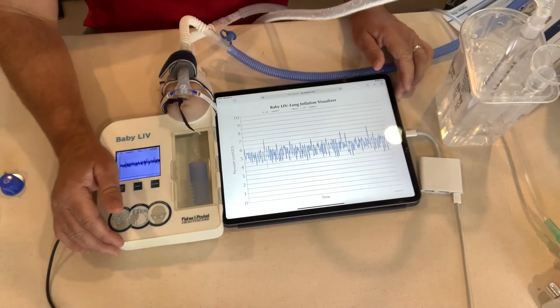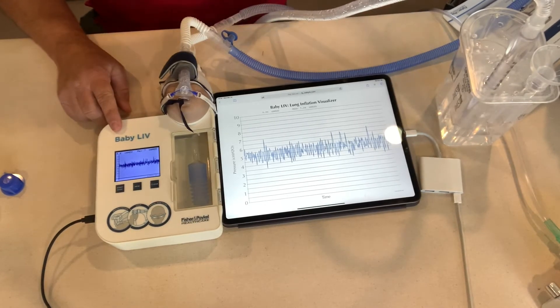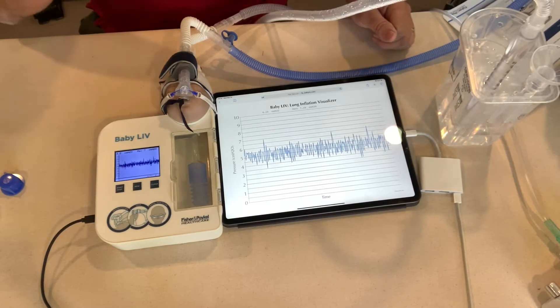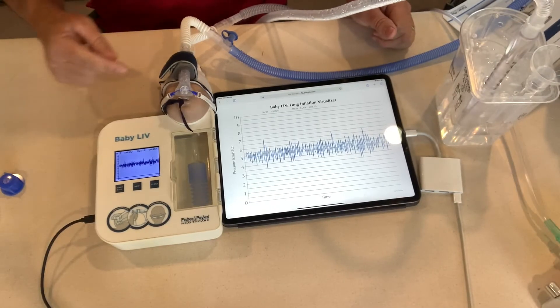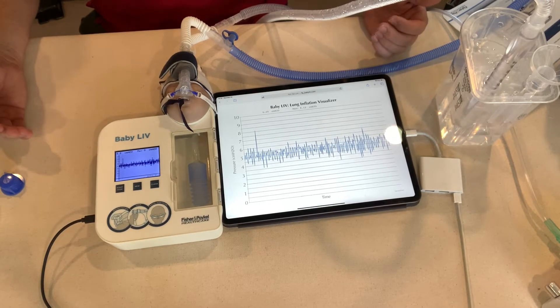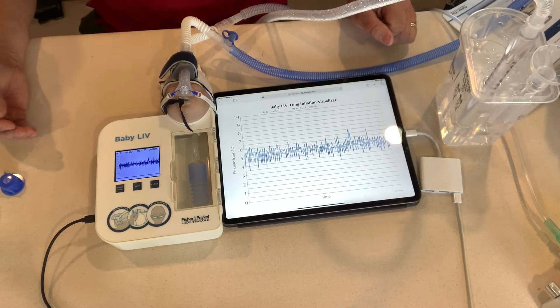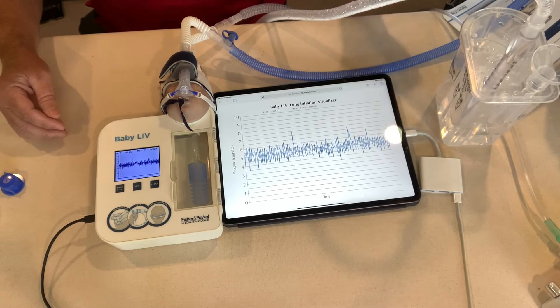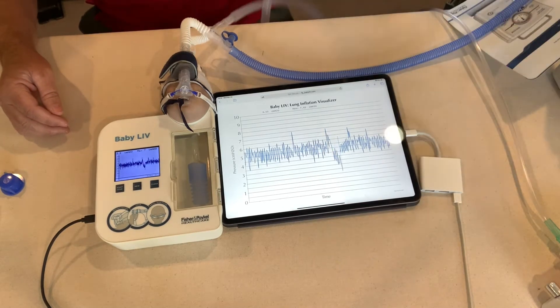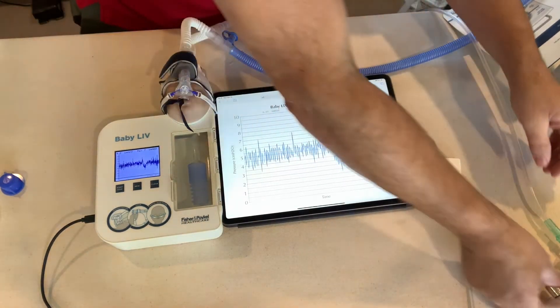Let me draw your attention to what's going on. I have my Baby Live going, I have my baby hooked up to a bubble CPAP system using the Flexi Trunk. I just wanted to get a baseline of what five centimeters of water pressure would look like so we had something to base it off of. I have my iPad here so you can clearly see it, and we're setting our flow to get our five centimeters.